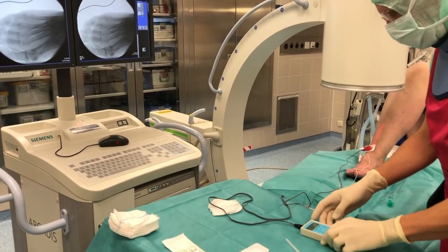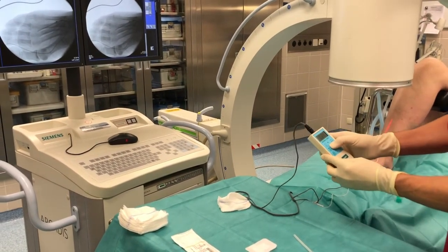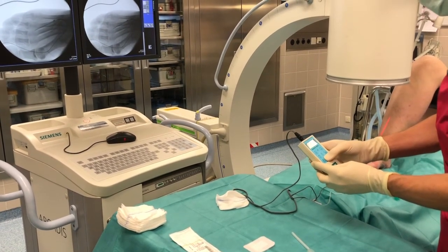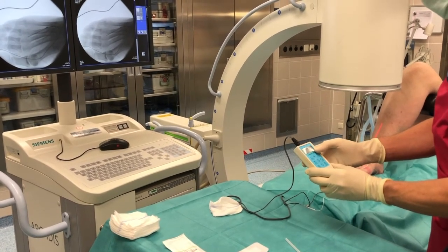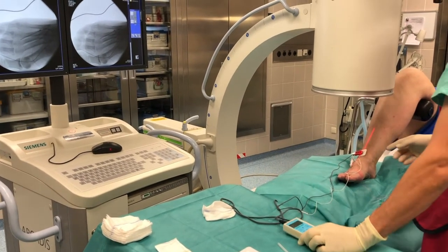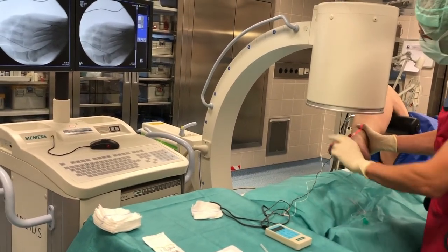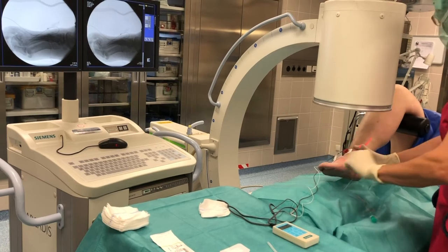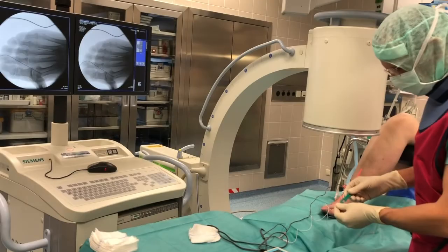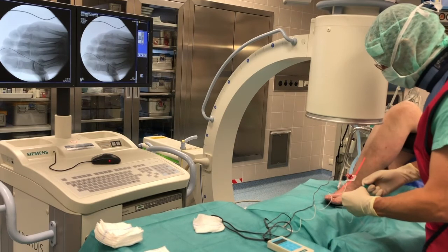In this case I am right at the first injection, which is not always the case. When the radiograph is good I start my electro-neurography as described with 2.5 mA and ask the patient if she feels pain in the respective two toes. Then I decrease the current, and if she still feels pain with 0.5 mA then I know that I am quite close to the nerve. I check under the fluoroscope if the tip of the needle is not too far plantar or dorsal and if it doesn't exceed the MTP joint line.